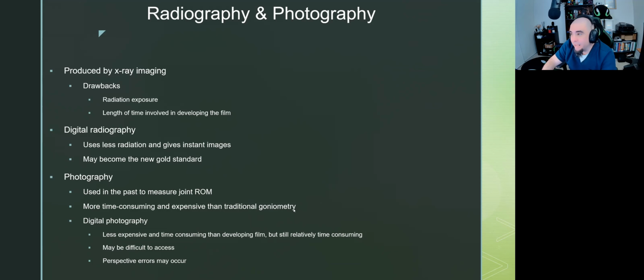The one nice thing about that is the patient can then also see the change. You can show them, look, here's where you were 6 weeks ago. Here's where you are now. So you are getting some progress. I'll say a lot of patients really like to know their goniometer numbers. It's funny when they say that, but they really love to know their goniometer numbers. It's just amusing to me.